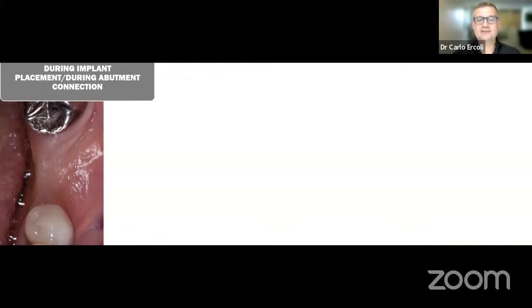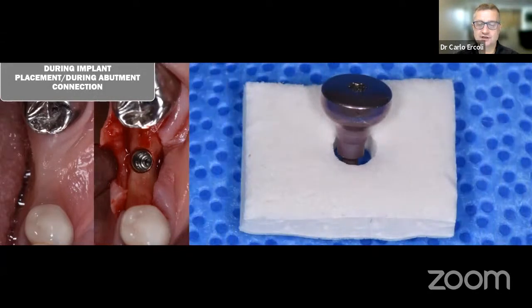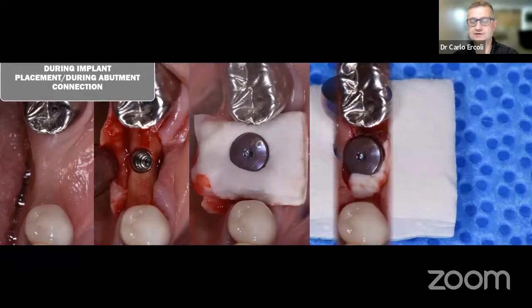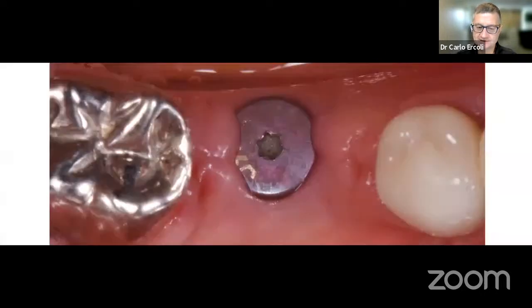You can then place your soft tissue during the implant placement. And again, here you might have a situation like you see here where you can place some allograft. You can stabilize it underneath your healing abutment. You place it underneath your flap, suture everything in place, and let that area heal so that you are able to thicken that tissue once again.